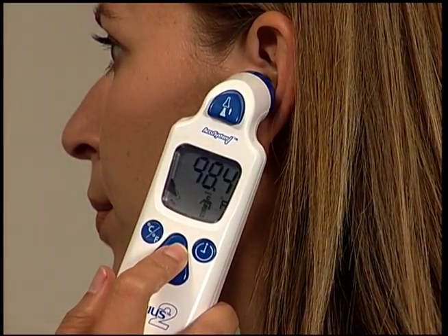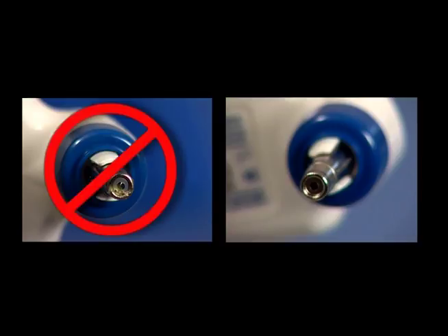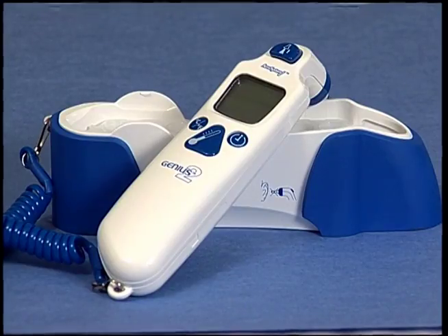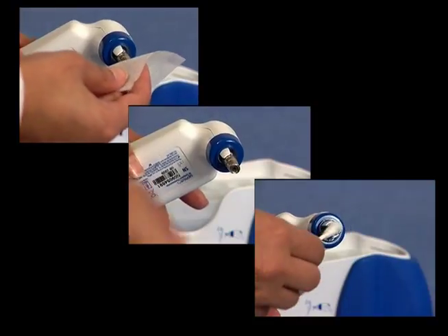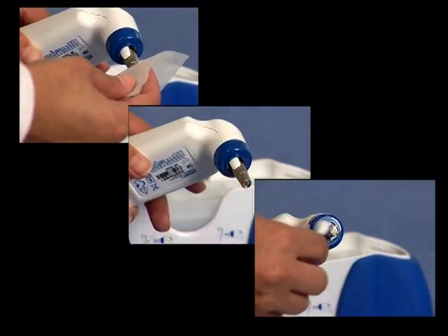It is important to keep your Genius 2 clean. Accurate temperatures depend upon a clean, unobstructed lens. Always inspect the lens before use and confirm a clean, shiny surface free of any fingerprints or debris. Regular lens cleaning is recommended for optimal performance. To clean the probe lens, gently wipe with a lens wipe, lint-free gauze, or cotton-tipped applicator.